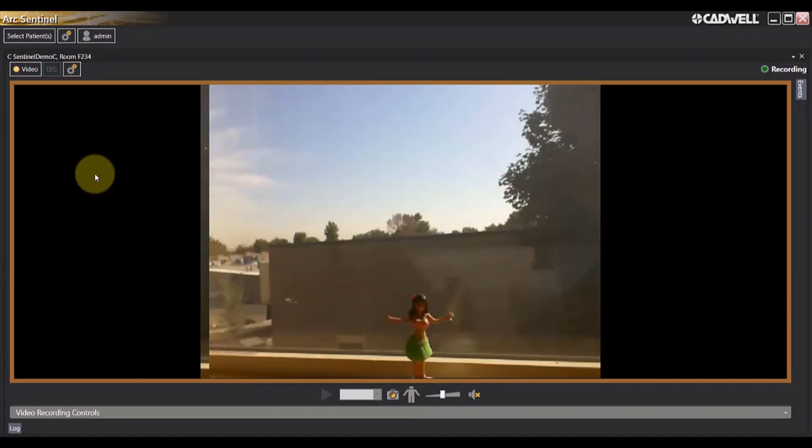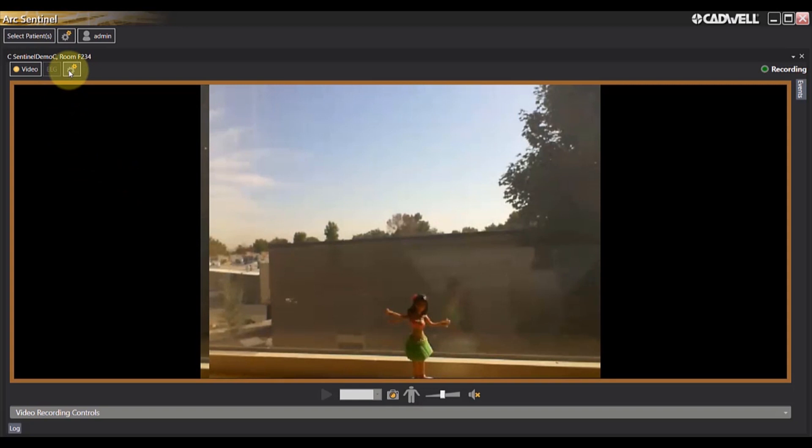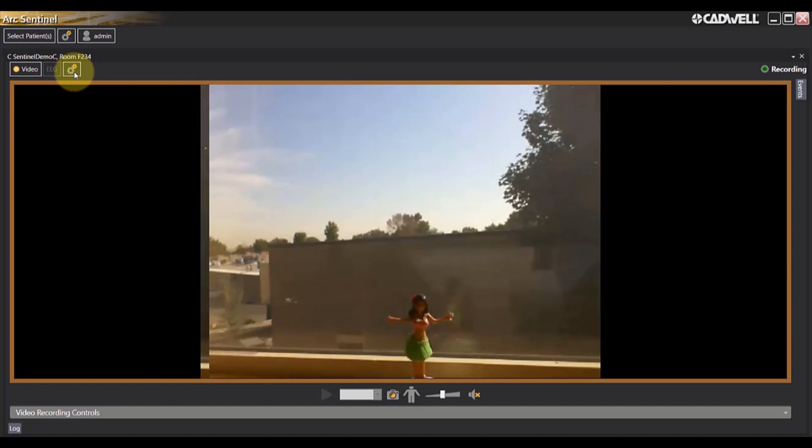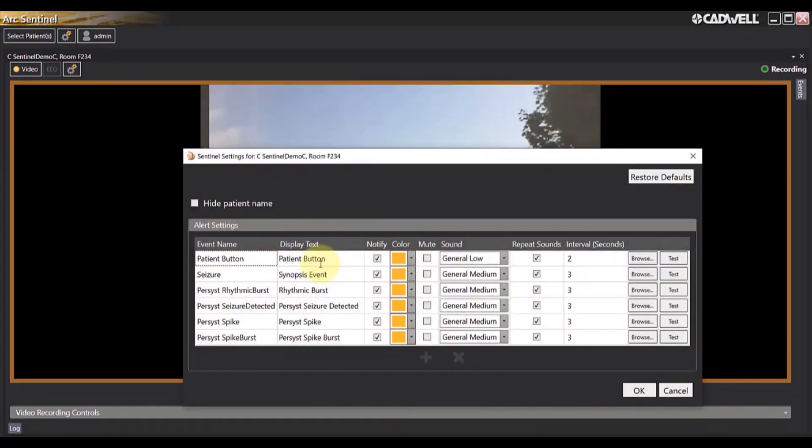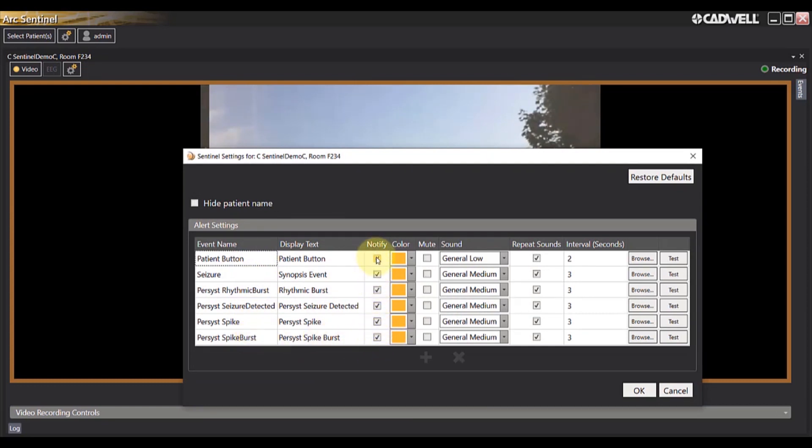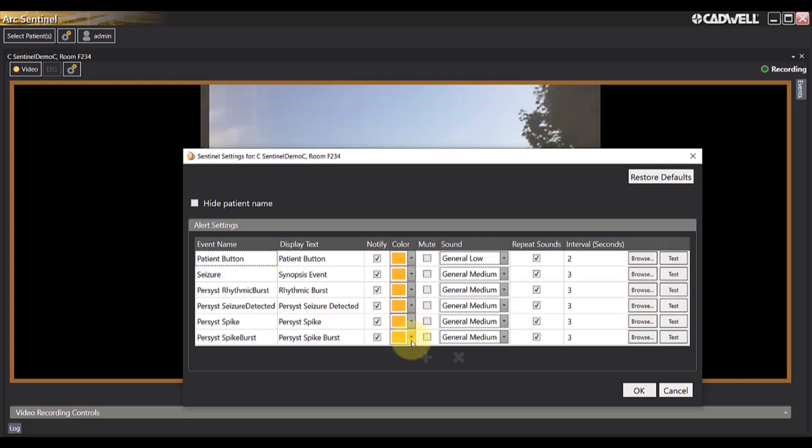To modify the notification settings for Sentinel, navigate to the settings icon below the patient's name in the upper left-hand corner. Here you can choose which patient event notification types to be added to Sentinel by choosing the Notify checkbox. You can also choose and customize colors associated with each notification type.